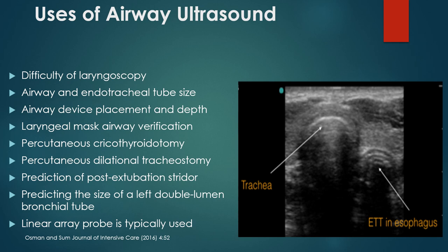Percutaneous cricothyroidotomy. This is a very big utility item here. I mean, I'm not sure if you've ever done a crack. I never have, but it would seem it'd be very nice to know if you had an anticipated difficult airway, exactly where to stick the needle and where to start doing the trach, especially if you are doing some ENT work, especially trauma surgery, things like that.